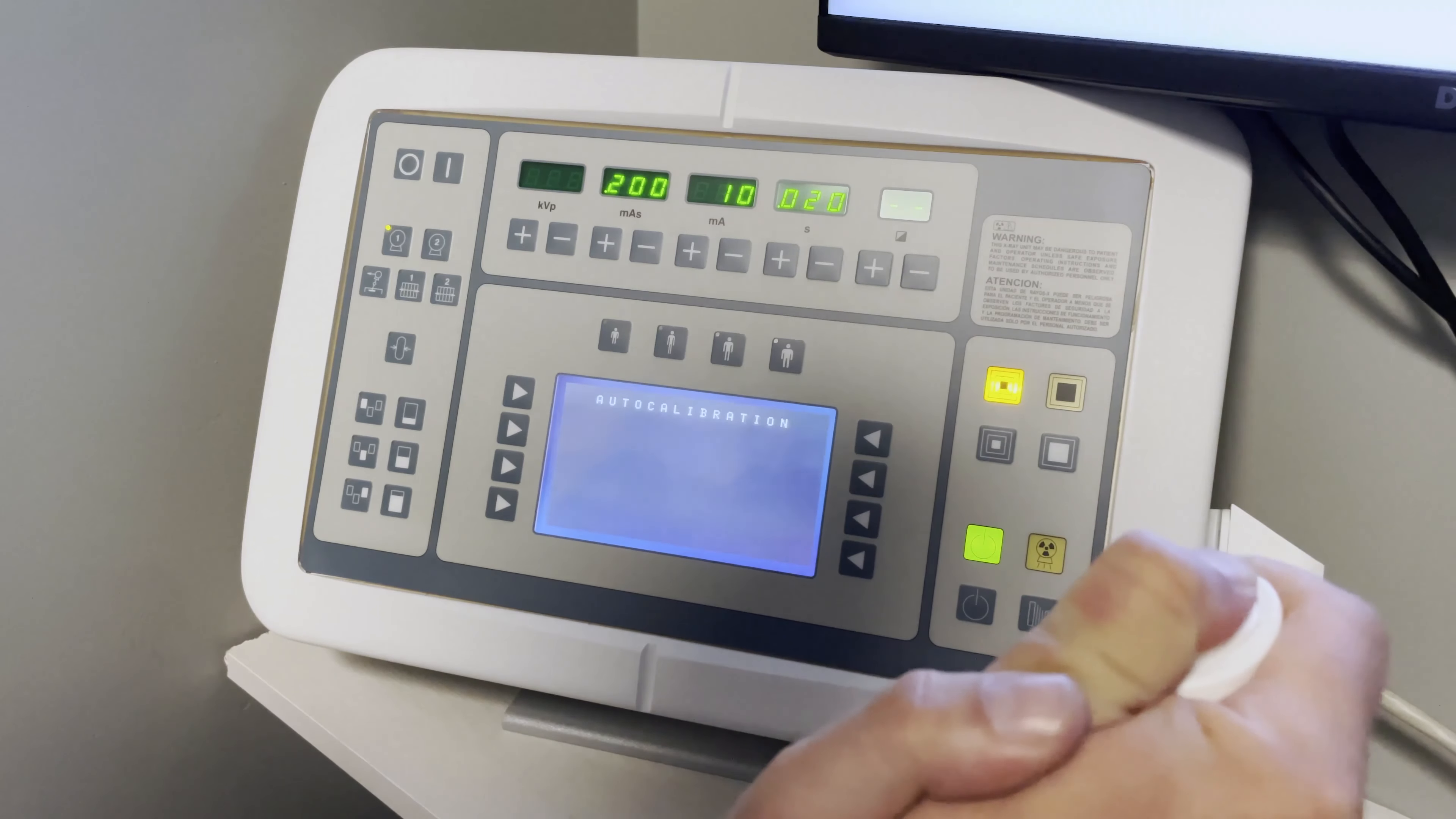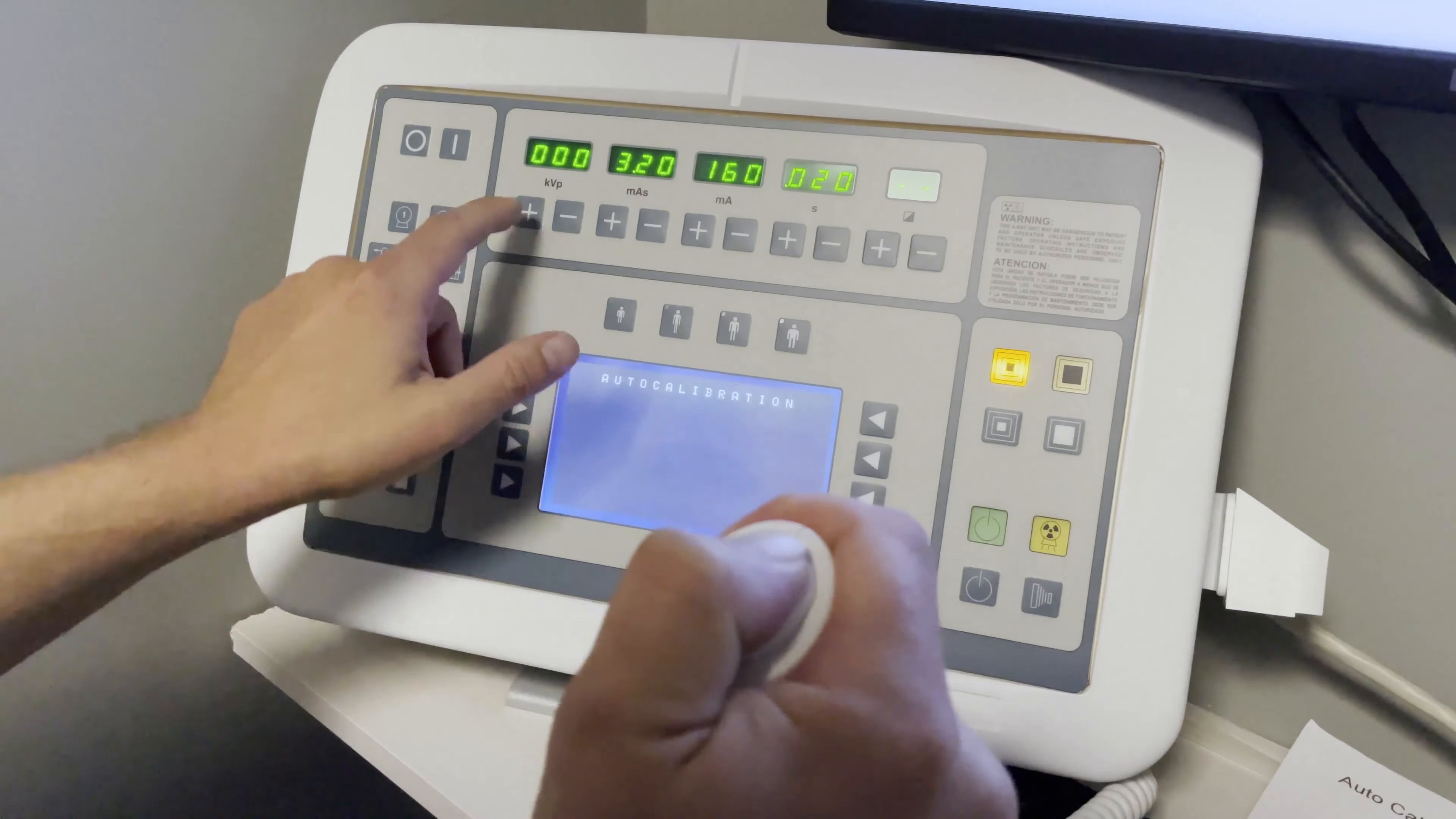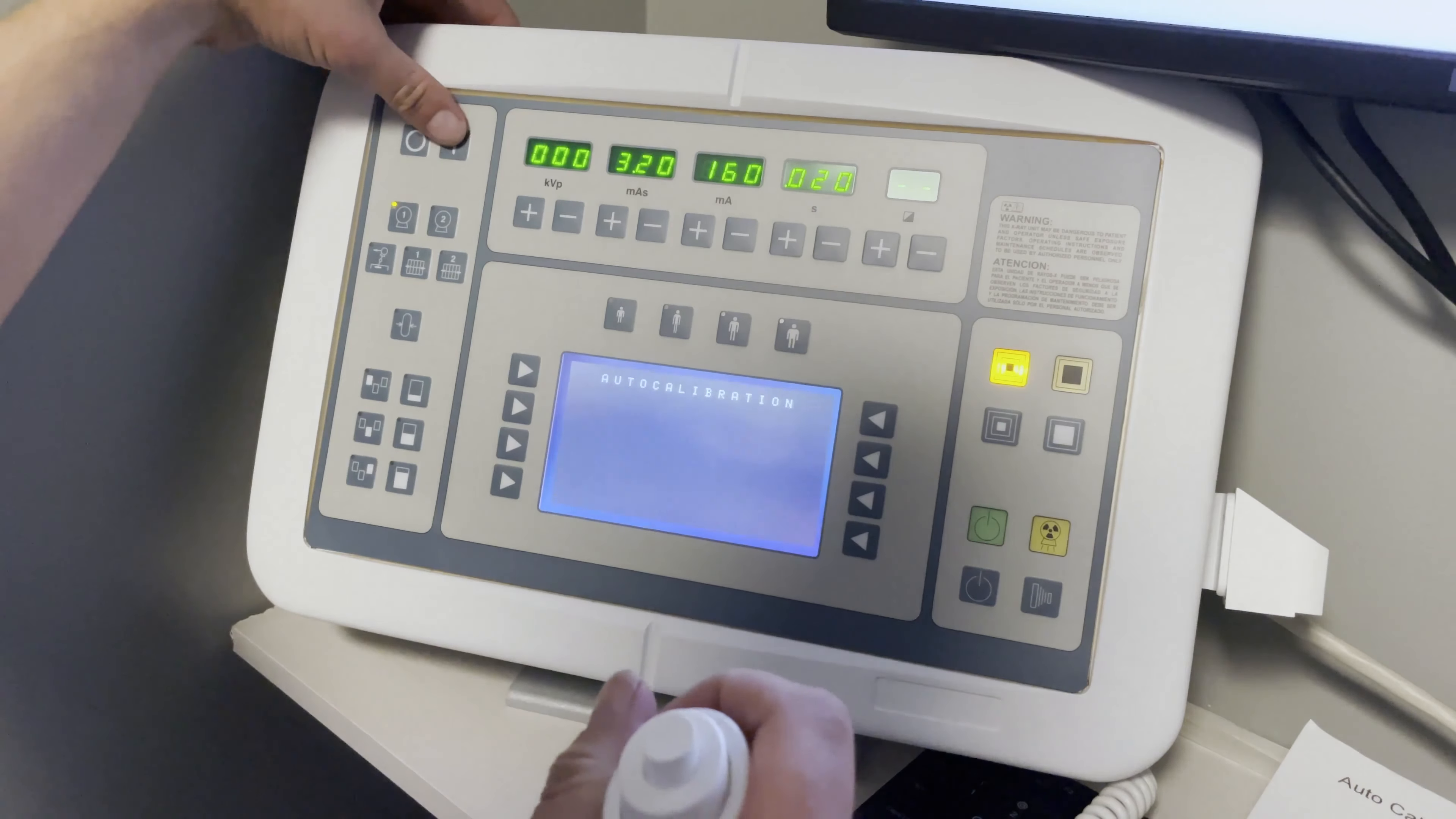You're going to hear the tube and the generator in the background taking a series of x-rays. Now that we've completed, if I see the nine nines on the KVP, I can now take my finger off. And we have calibrated the low focal. The next step that you want to do is press and hold on the I button.